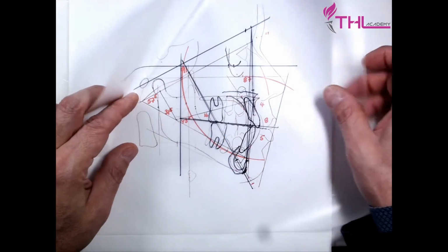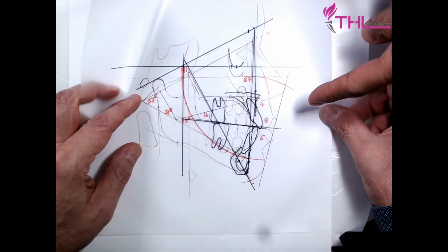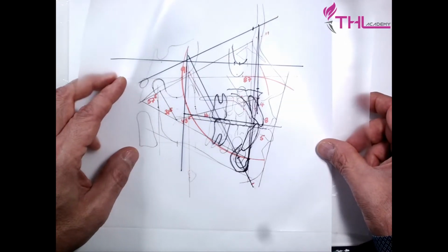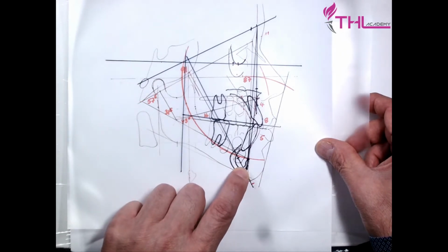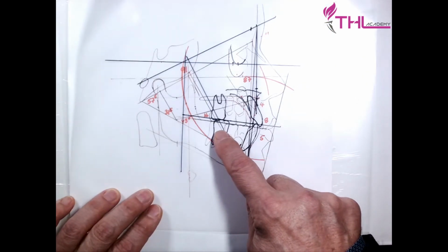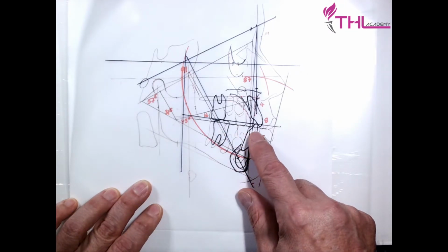Now I can put this in apogonium. The last superimposition, you mention menton. If you put in menton here, yeah, okay, so I can measure here. I don't know if you can see. This is the anchorage loss, and this is the change in the incisors.